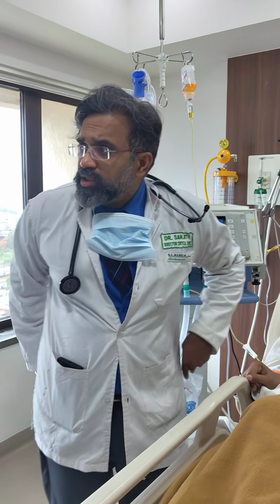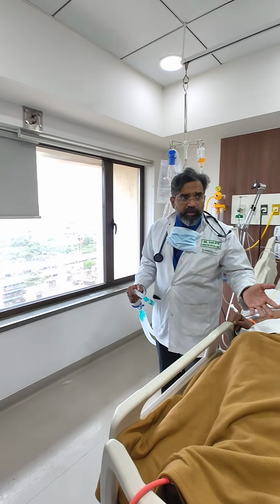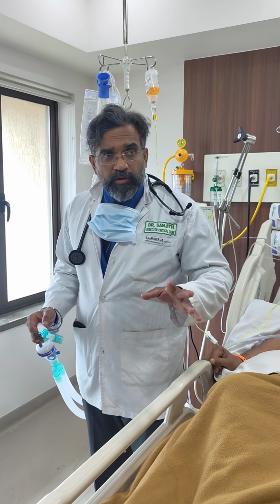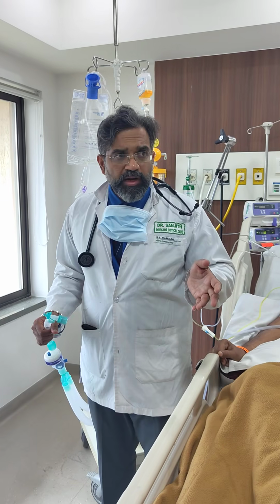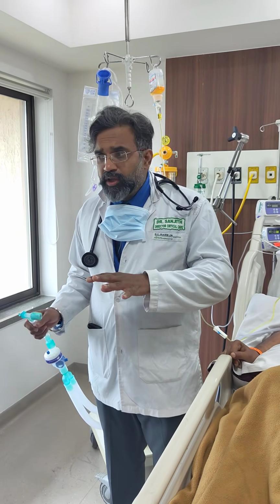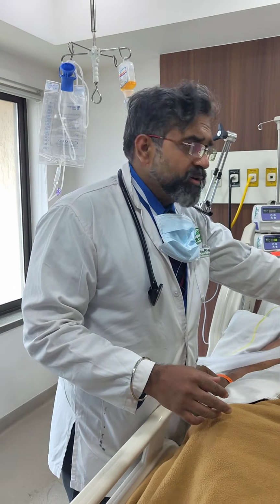You have a patient who is being mobilized and/or on SBT or any kind of weaning mode, and the patient gets tired and the SBT fails, or for that matter the T-piece trial fails, or the pressure support trial fails, whatever fails. If something fails, especially after the patient gets tired, it's important what kind of mode you apply. Tell me, what kind of mode do you apply?